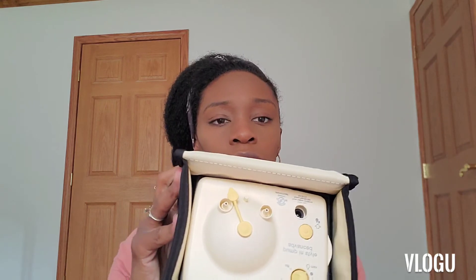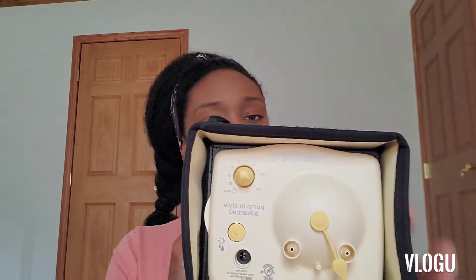And then this is probably the regular adapter for the wall plug-in. Last but not least is the actual pump itself — that's how that looks. And this is a lot smaller than the first Medela pump eight years ago that I got. That was like a duffel bag size. It's smaller and a lot handier than carrying a huge bag.